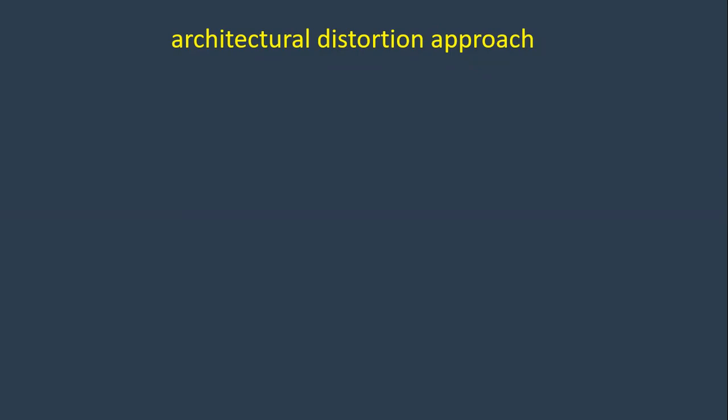Then if we have seen some changes, we request a spot compression, and we determine the area or the position of the abnormality. Excellent.